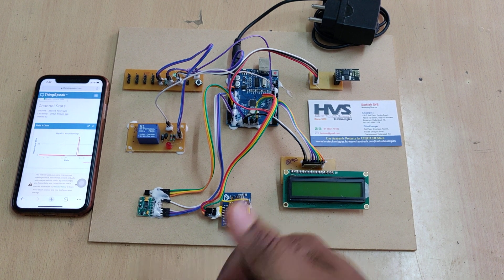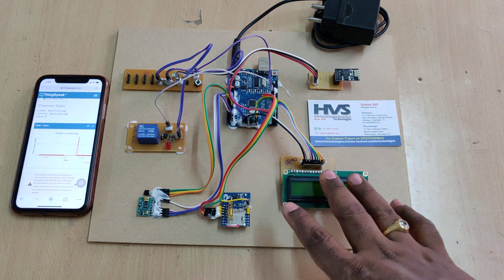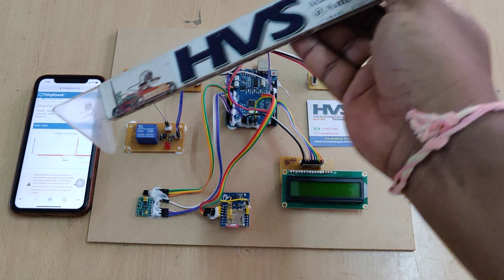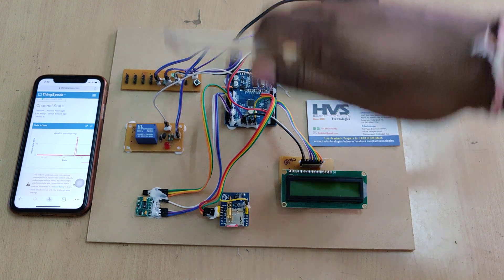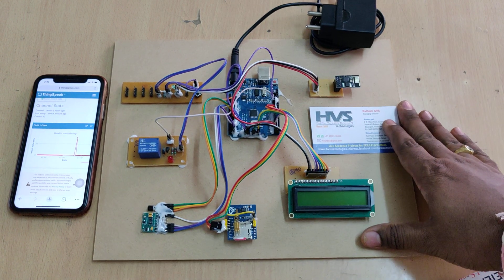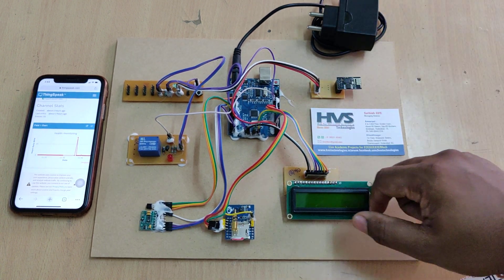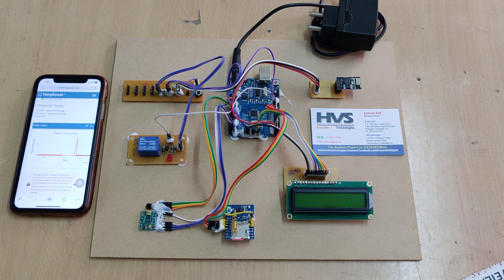You call the SIM card and the number will be stored by the microboard until the system is switched off. With the help of the ESP8266 module, we send data to the ThingSpeak cloud platform. The breadboard distributes the power supply and also has a panic switch — when pressed, we get SMS alerts and the relay switches on, connected to a buzzer. The LCD display continuously shows the status and health parameters.